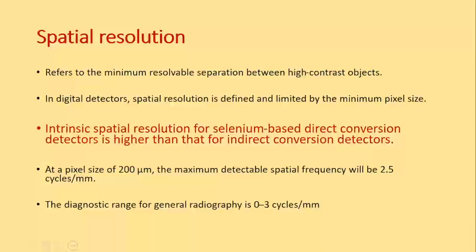So if you have to look at something like that, when I talk about 2D, just to give an example, say, intraoral periapical radiographs, the small 31 by 41 mm film that we all held in our hands as undergraduate students, the resolution for the IOPA film is roughly about 18 to 20 line pairs per mm. It means in 1 mm, this intraoral periapical can see 18 line pairs, 2 lines. Can you see those 2 lines together? Like that, 18 or 20 in 1 mm. That's what an intraoral periapical can see.